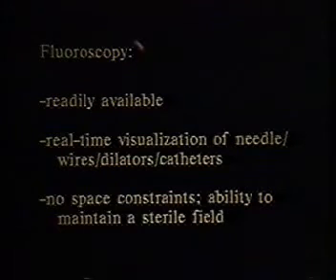So we often use fluoroscopy if we feel that we're going to need a lot of room, a lot of space, and when we can easily see the fluid collection that we're draining on fluoroscopy. In this situation, the patient is placed right side down for this loculated left posterior pleural fluid collection, which is very easily seen.